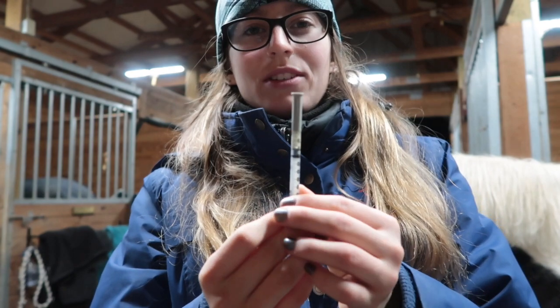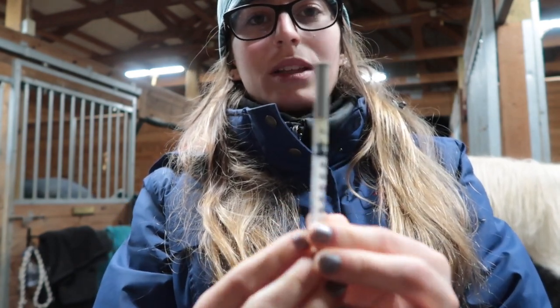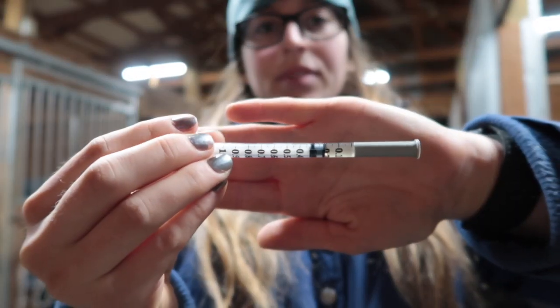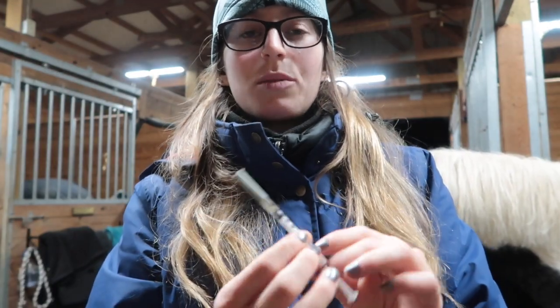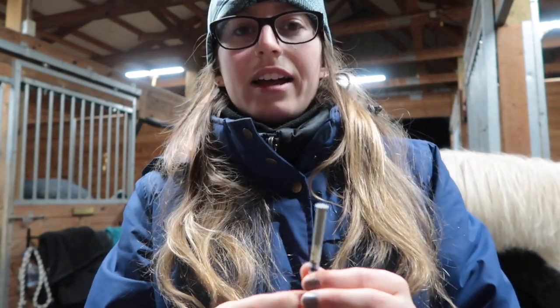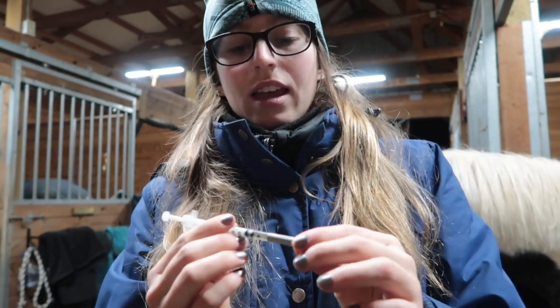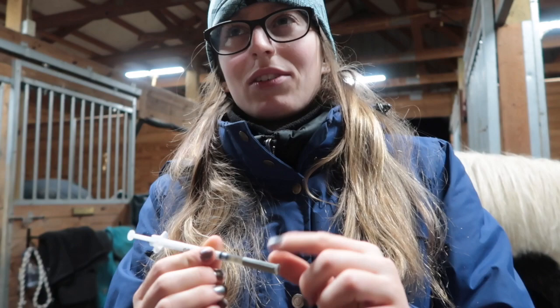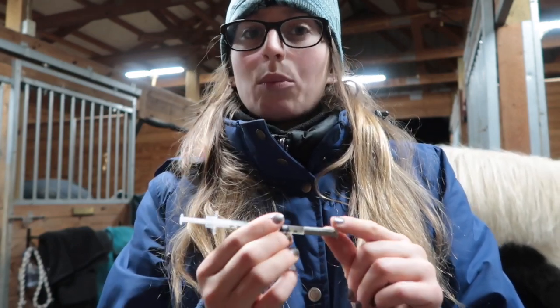So this is the injection that I'm going to give today — it's only 0.2 cc's or 0.2 milliliters. This one goes under the skin, so it's subcutaneous. This is just a 1 milliliter syringe and it has a half inch, 27 gauge needle, so it's really really small — they shouldn't really feel it.